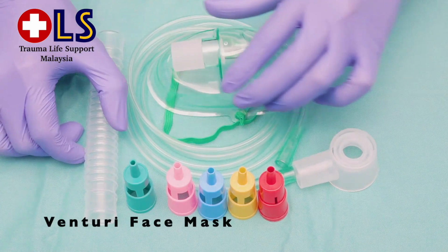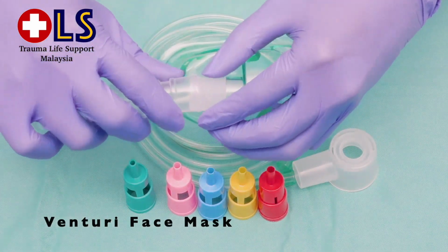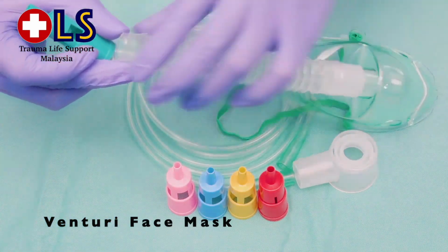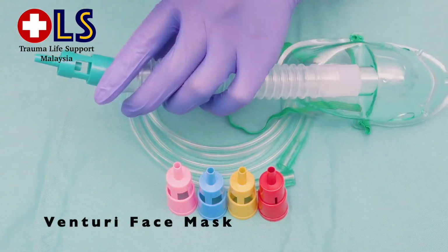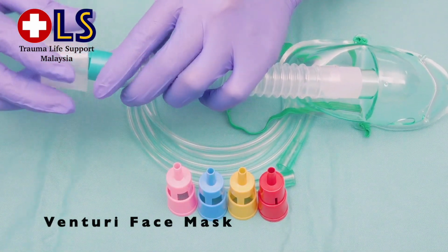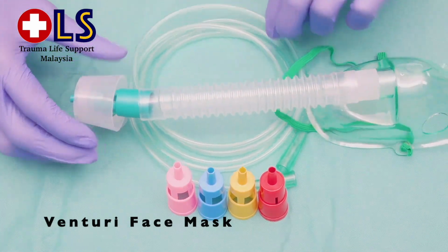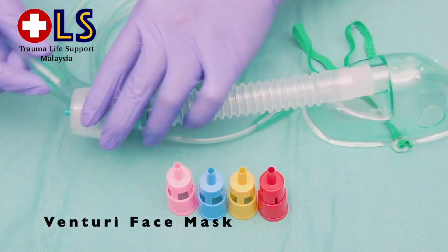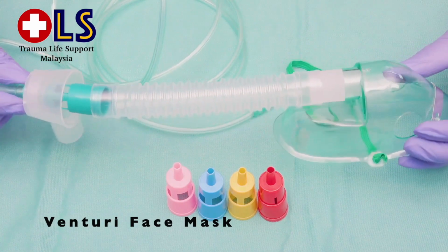Now, assemble the equipment and attach it to the oxygen supply.